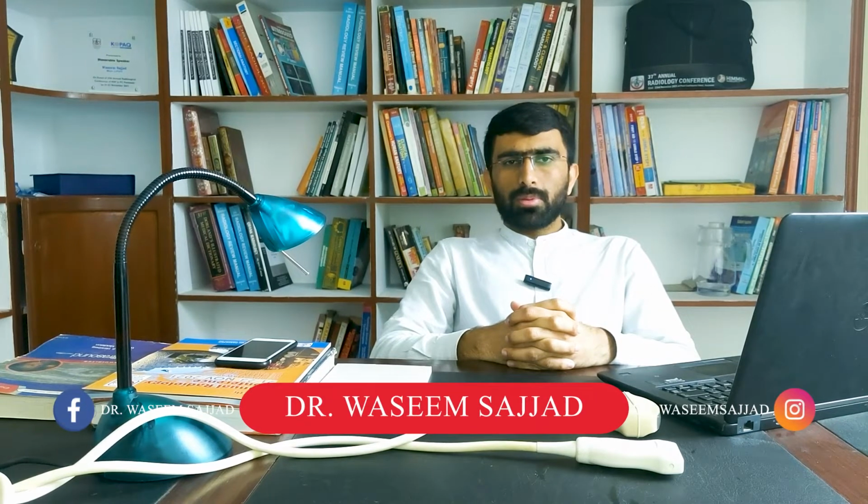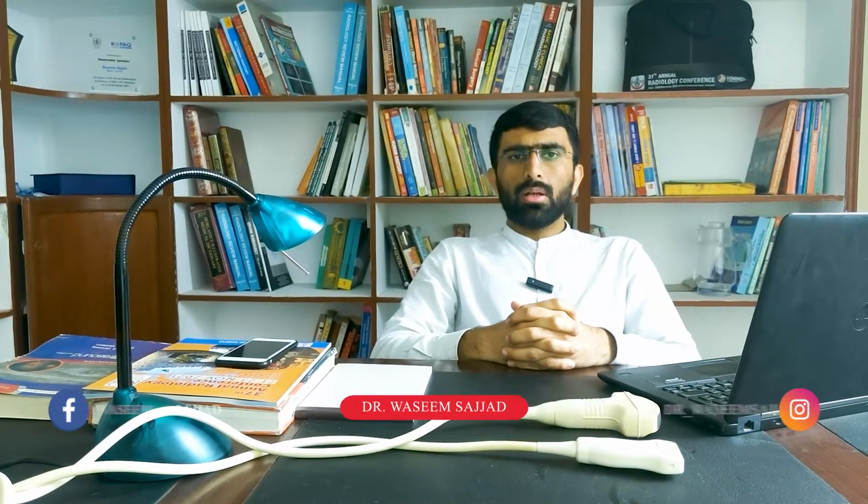I am a diagnostic and interventional radiologist, and today we will learn about ultrasound probes. In the previous lecture, we discussed echogenicity and ultrasound probe handling. In this lecture, we will learn and understand ultrasound probes, probe orientation, and probe handling in detail. This lecture is very important for sonographers, sonologists, and basic ultrasound learners.